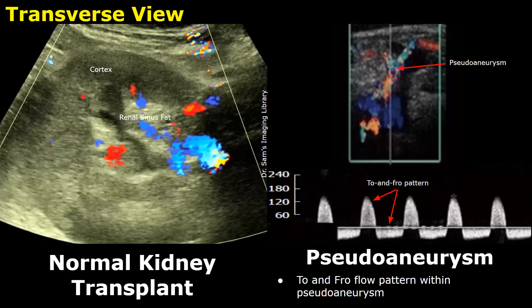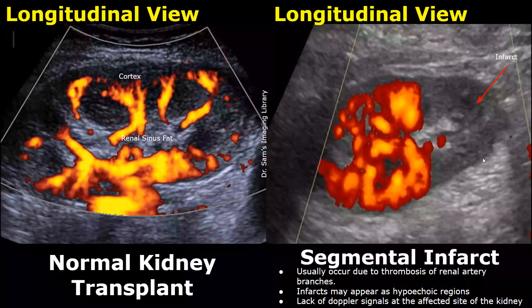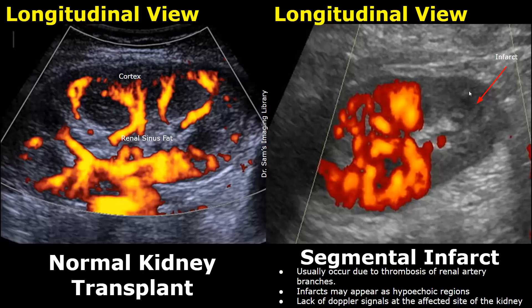Segmental infarcts can occur in our renal transplant due to thrombosis of renal artery branches. The infarcts may appear as hypoechoic regions, but they are best seen with Doppler. Here, power Doppler is applied and we do not see any Doppler signals within the lower pole of the kidney, indicating infarction.